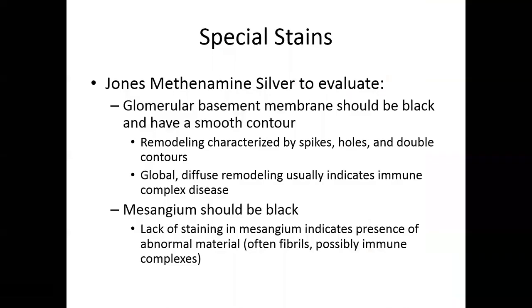Okay, Jones stain. I have plenty of people email me asking, can I just do a GMS because my lab knows how to do a Gomori methenamine silver and they don't know how to do a Jones? A GMS is never going to work. It has to be a Jones. And it does take a while to work it up in your lab. Our lab and Texas A&M's lab does an amazing Jones stain.